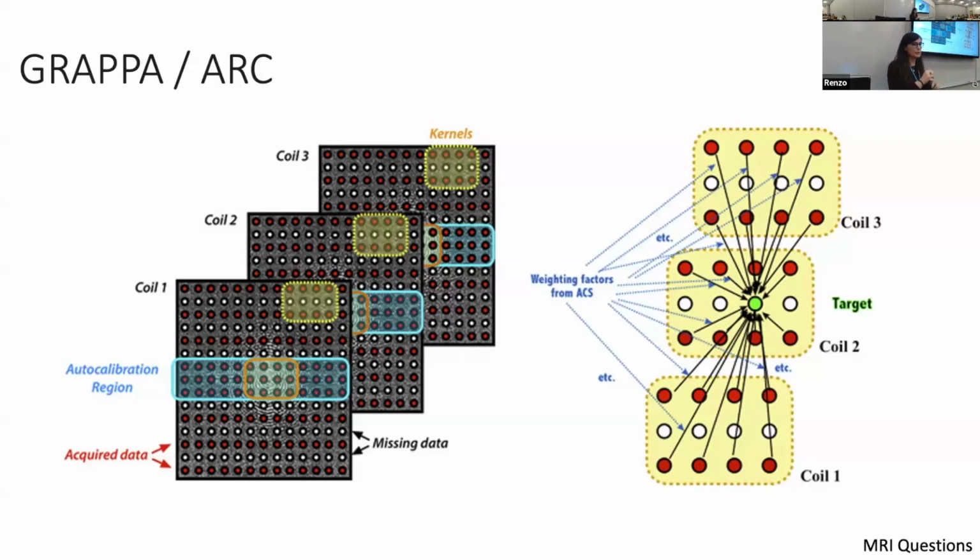So in the SENSE example, we were trying to set out a set of equations where we take voxel values that we knew or recorded and try to untangle them. Here, we're doing something similar. So we're taking basically all of the different coil elements, and we have the same kind of k-space in those coil elements, and we're going to use all the other coil elements to try to train a model to fill in the k-space points that are missing.